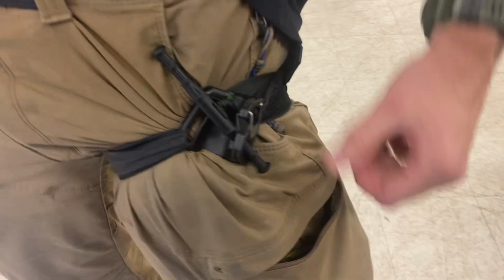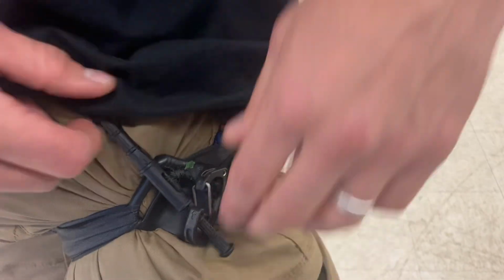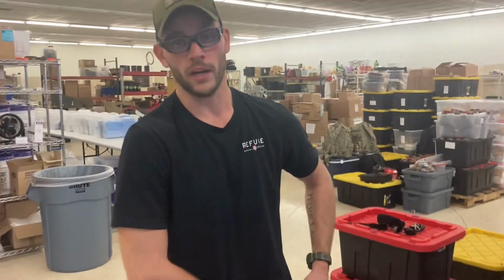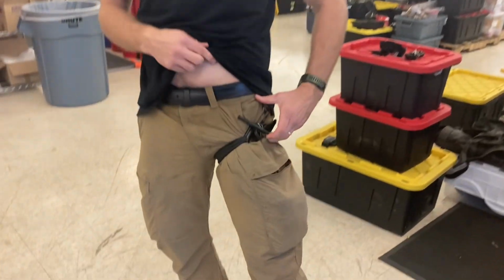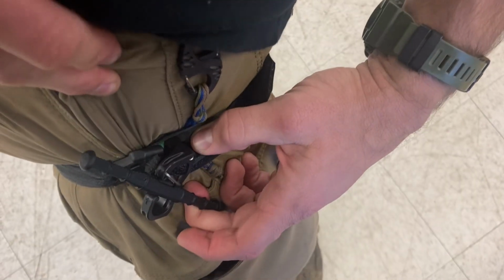But you can see here, it's torqued up again. It's twisted, it's bad. It's so close to the center of that windlass that it really won't even catch. And again, if there was any swelling from this being a real injury, I'd have to go more. So let's give it one more, and look at the torque that it's getting now. Look at that. Now it's not going to do it. See if you can get it top down, because it's actually folding that polymer. Oh, I sure do see that.